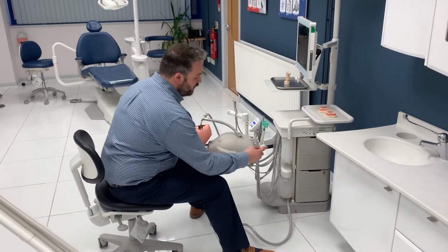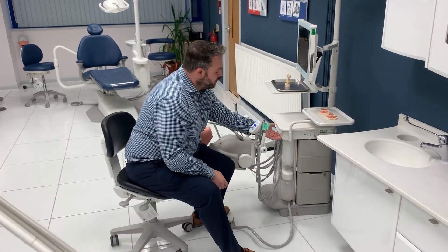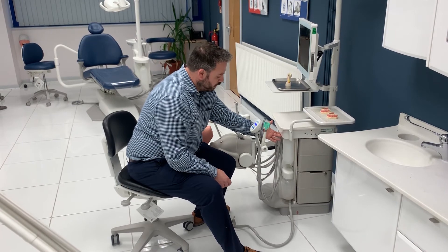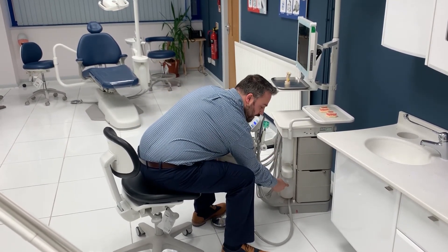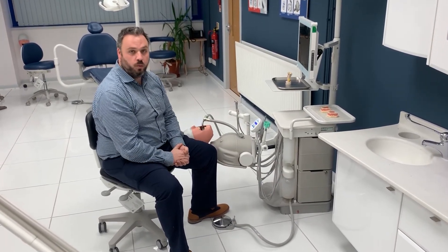To feed water to your handpieces, you have this bottle here, which you can unscrew. To unscrew the bottle, you need to depressurise the simulator by turning it off. Once that bottle runs out of water, you'll notice that this collection bottle here is full. At that point, we recommend that you dispose of that water and replace the feed water bottle with fresh water.